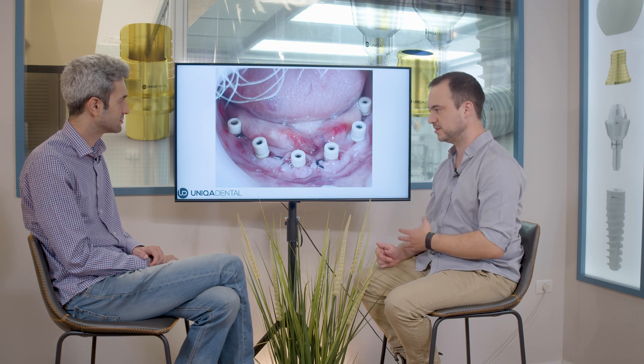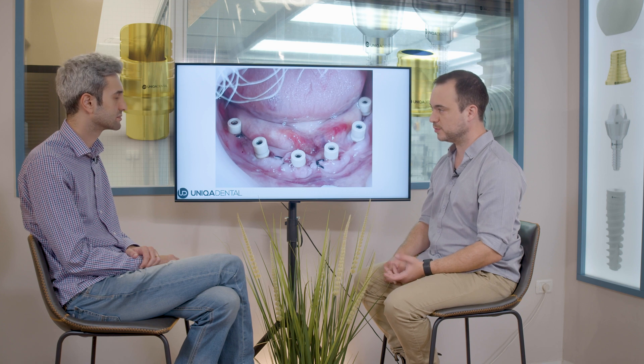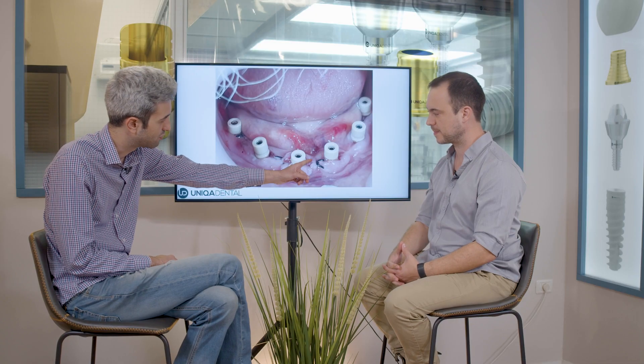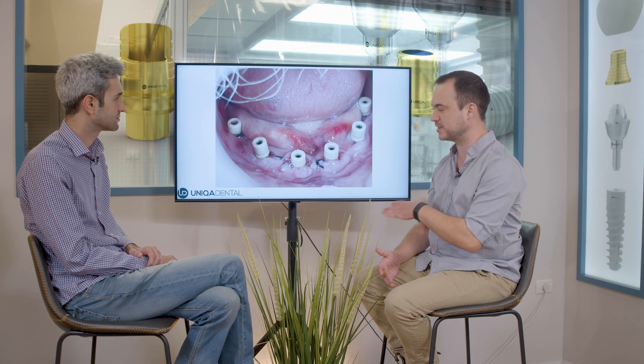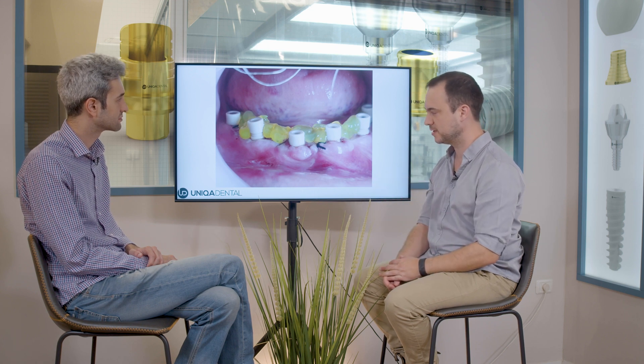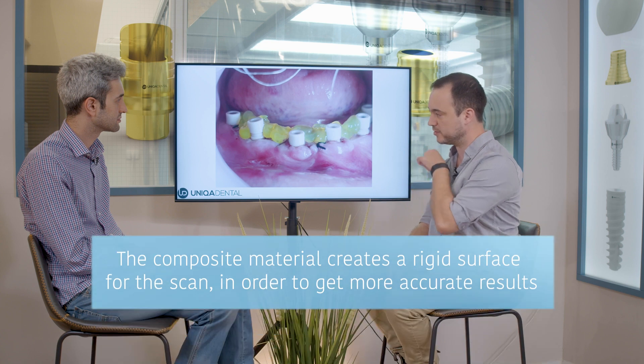If you want to take an impression with, for example, an open tray with transfers, it's very difficult because the patient has a very large tongue. What we chose to do is connect all the scan abutments with composite material. The yellow material you see is light-cure composite. We connected all the scan abutments, and this way, when we scan, we have one rigid bar that connects all the implants.